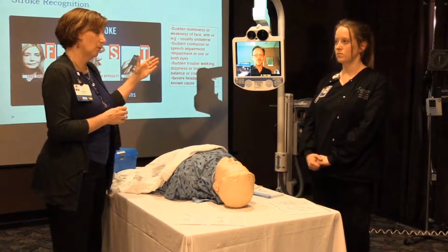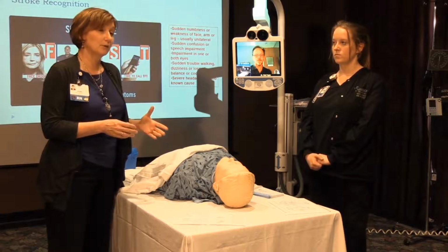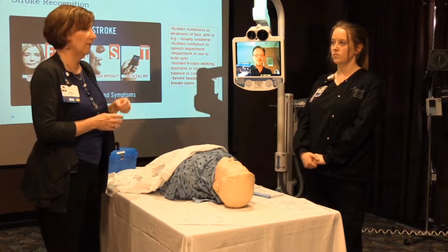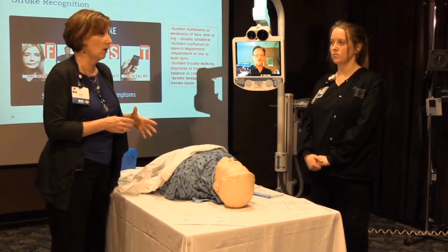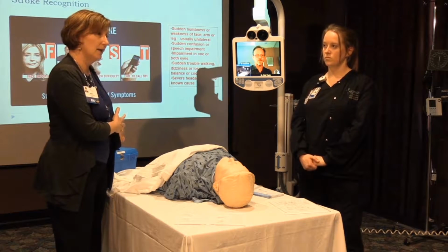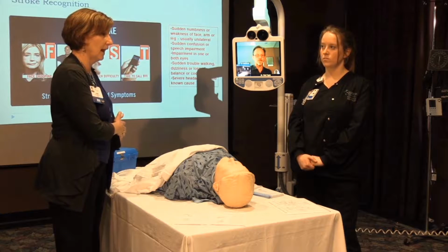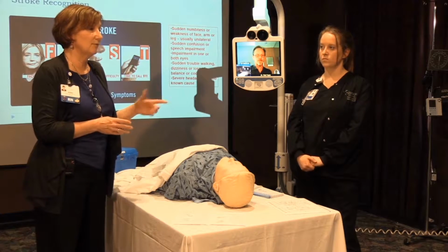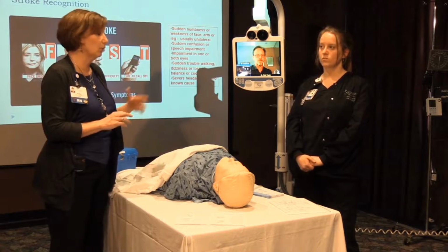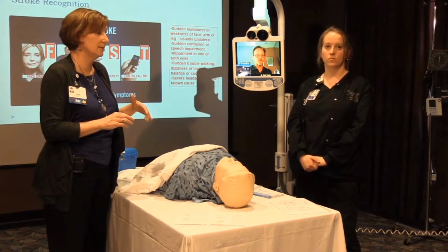When you're bringing the patient back to the room, you want to make sure that you have the device in the room. You don't want to have to be going down the hall and finding it behind a cart. You want to have it in the room. You want to go ahead and have your TPA clot box available and handy, and you always want to have a staff member, an RN and or the physician provider in the room when the telestroke doctor joins the case.